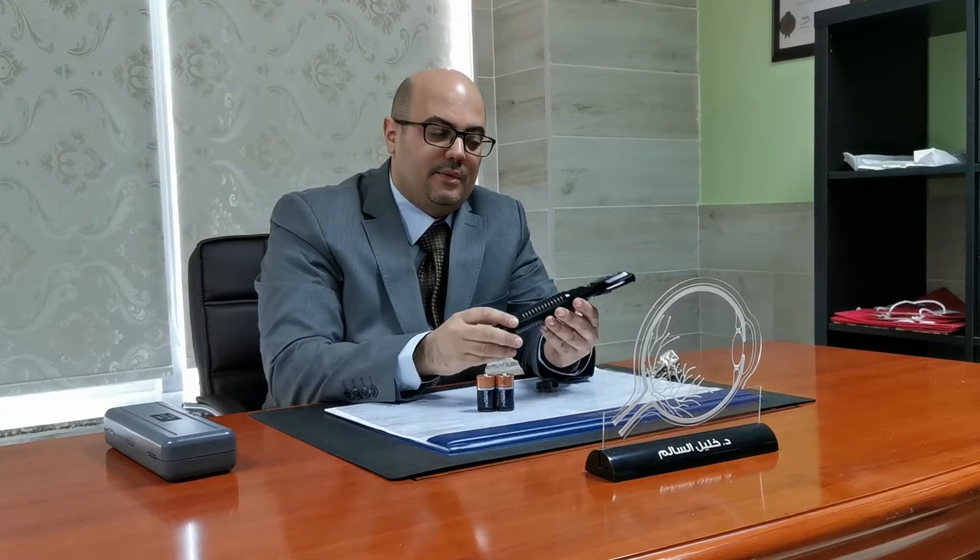Good morning everyone. Today we're going to talk about direct ophthalmoscopy. This is a very useful tool — we use it at bedside, we use it at the clinic, and it's a very nice portable device. The device is just a source of light with a hole.